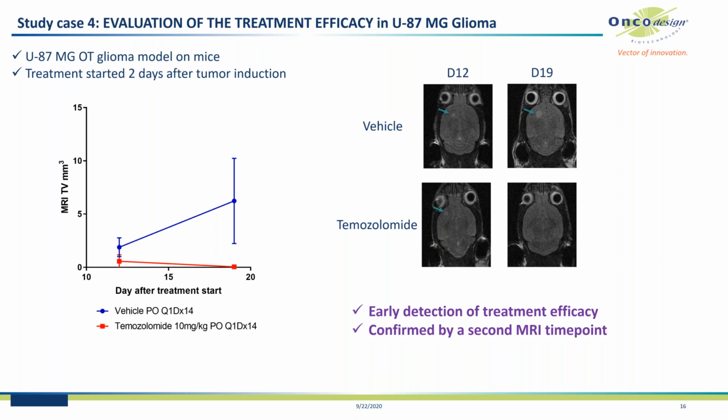But two different MRIs were performed during the course of the treatment to evaluate the response to the treatment. And at the first time point, the difference between treated and vehicle groups was already visible, but it was confirmed by the second time point, where no more tumor was visible in the treated group.